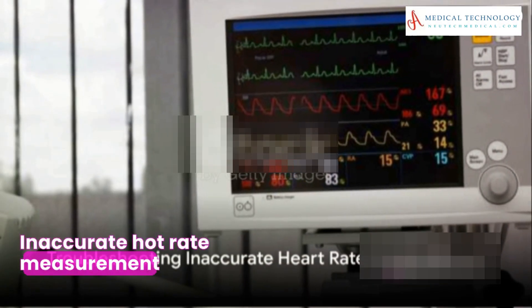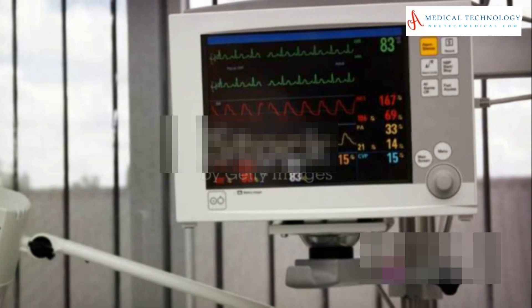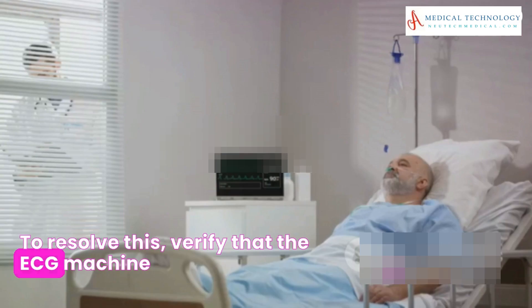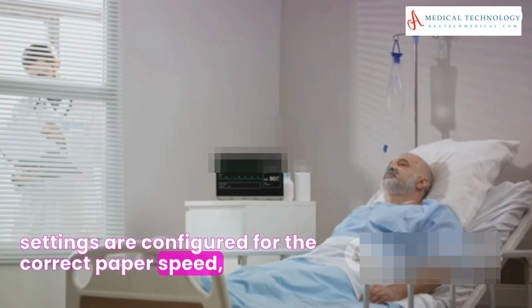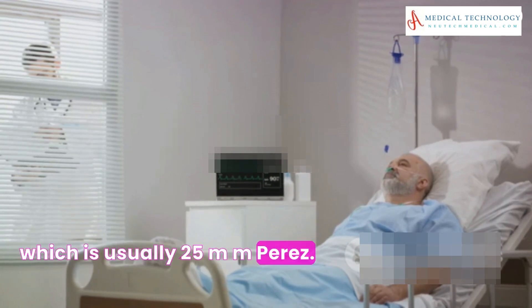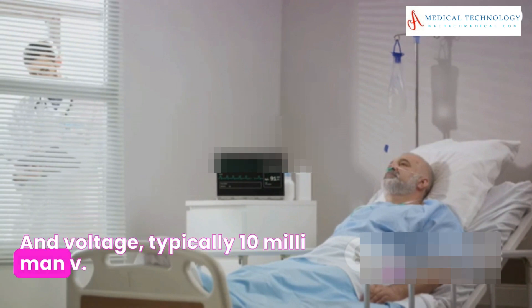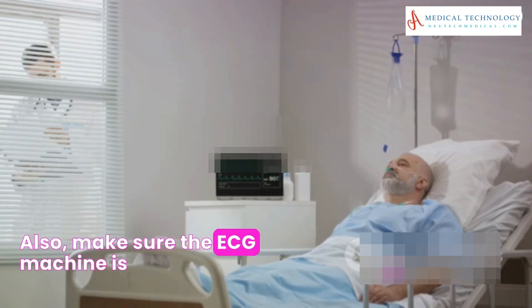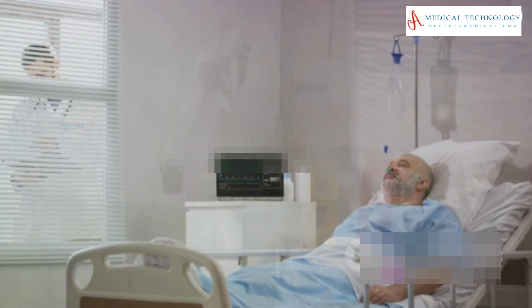Inaccurate heart rate measurement is another common complaint. To resolve this, verify that the ECG machine settings are configured for the correct paper speed, which is usually 25 mm per second, and voltage, typically 10 mm/mV. Also, make sure the ECG machine is set to the appropriate lead configuration.